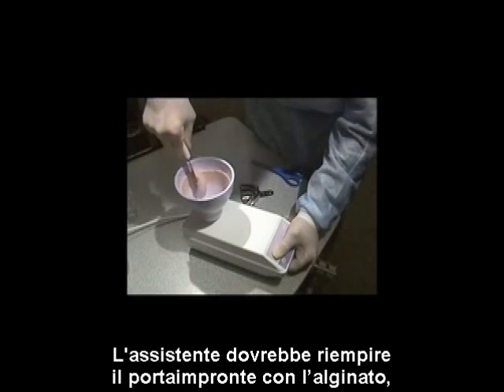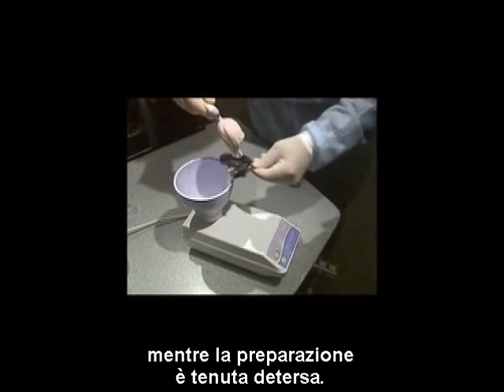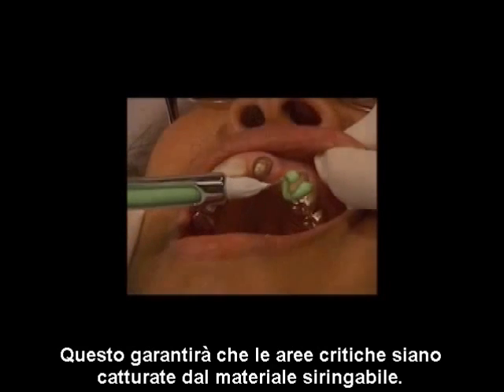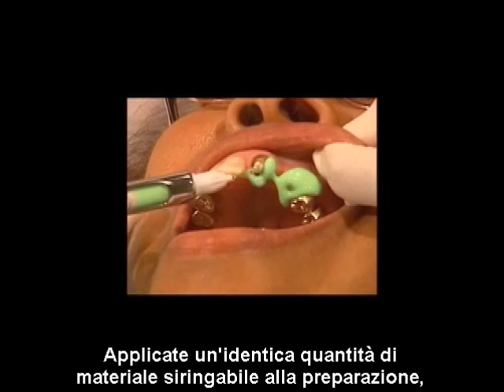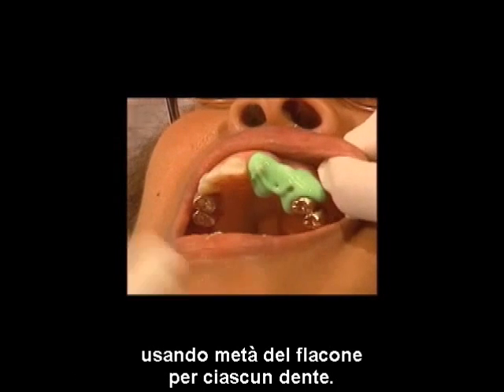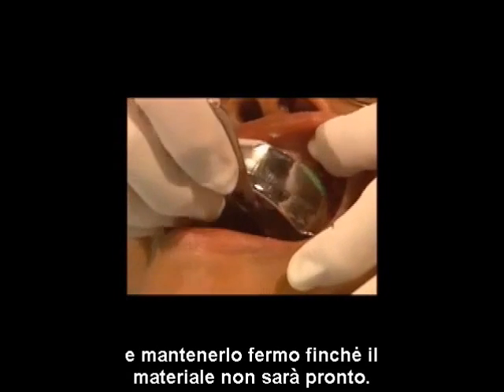The assistant should fill a tray with alginate, making a dimple where the preparation will be aligned. This will assure that the critical areas are captured in the syringible material. Apply identical syringible material to the preparation, using half of a vial per tooth. Immediately seat the tray and hold until set.